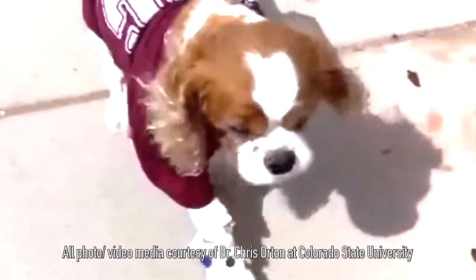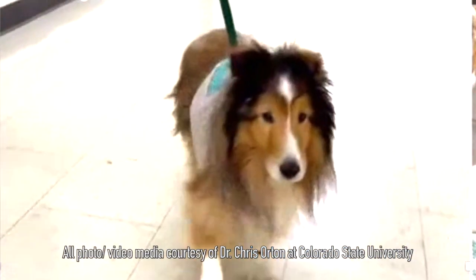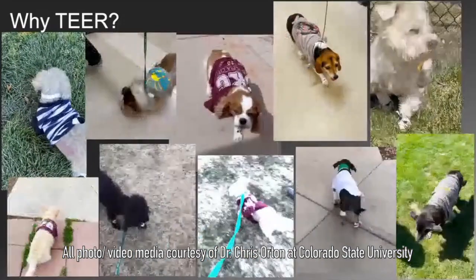This procedure, on the other hand, is appealing for a couple of reasons. By nature, it's a beating-heart procedure with relatively low risk. We've now done approaching 50 patients over the last two years with no dogs dying during the procedure.